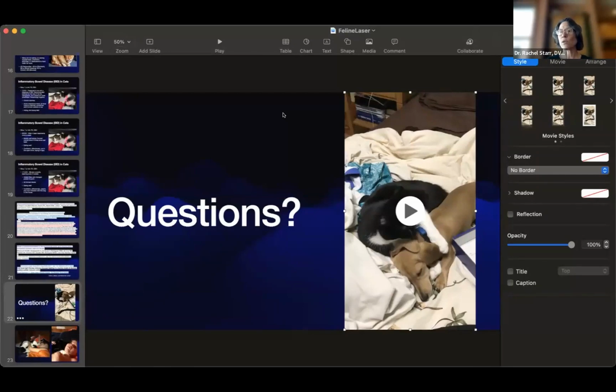So you can do that and input energy into the body. You are not going to hurt anything with these lasers. You can leave them on there for a really, really long time, and the power is so low that the body has the ability to dissipate the energy. You're just not going to get increased response probably after about 15 minutes. Though there are people on the human side of things that will run lasers for 30 minutes or longer.